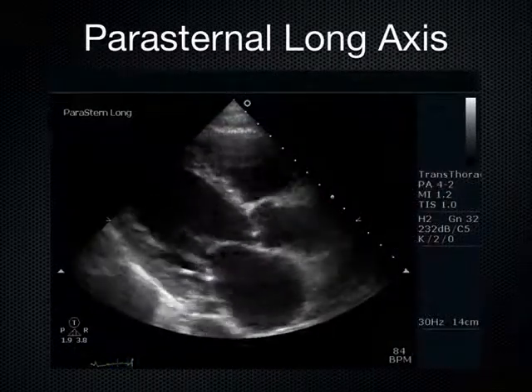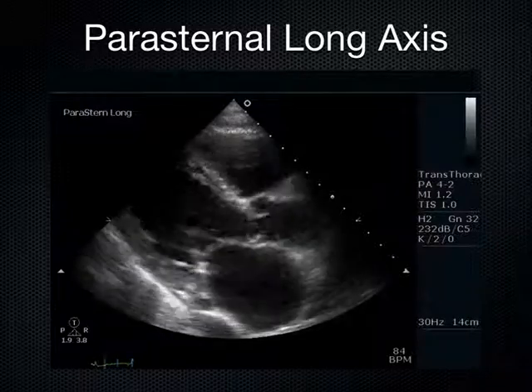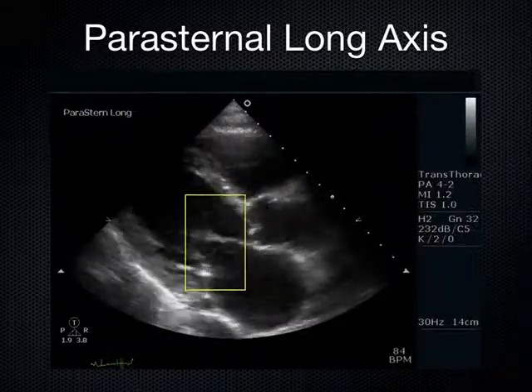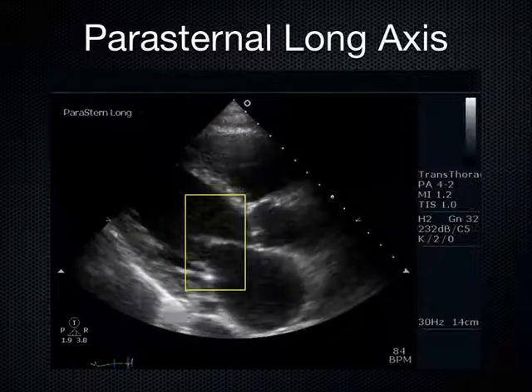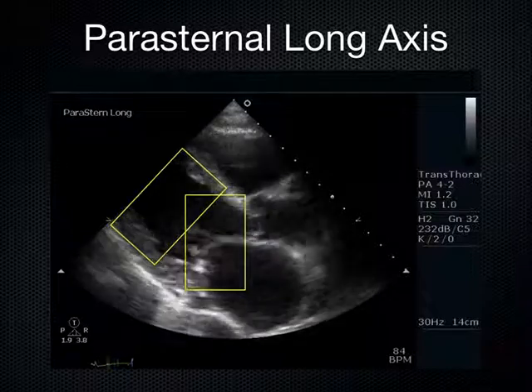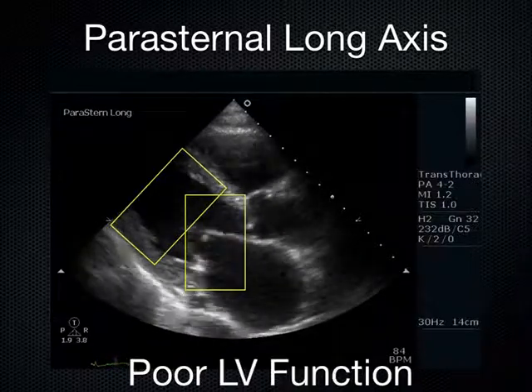How about this one here? Medications or fluids? Medications, exactly right. See that mitral valve there? Not really doing much towards the septum. And we come back there, we look at that septum and that posterior wall, not doing a lot for me either.